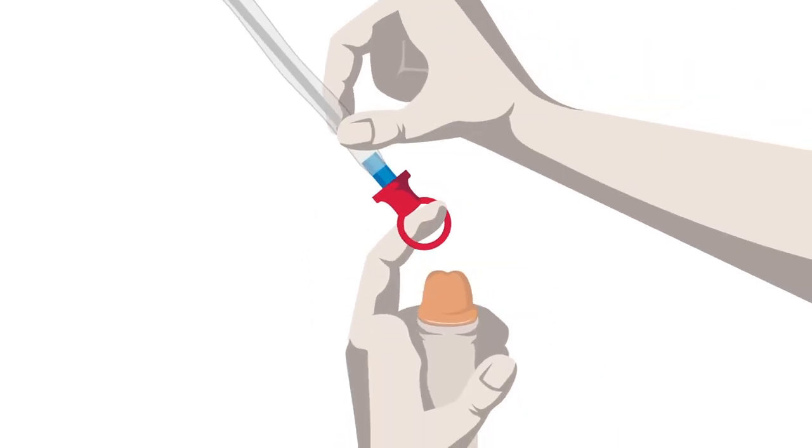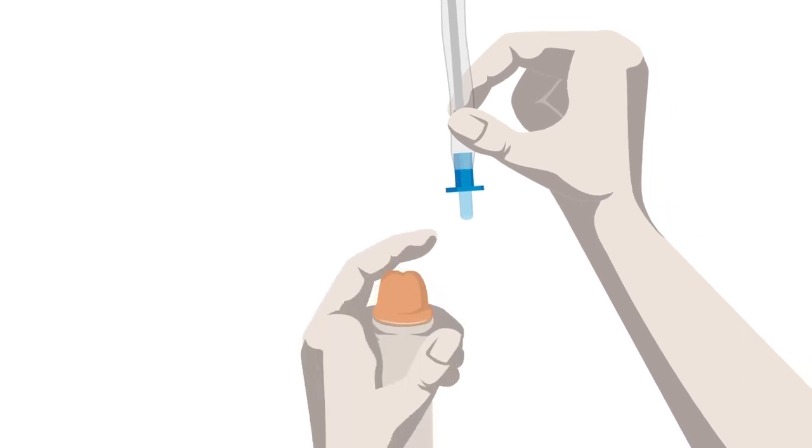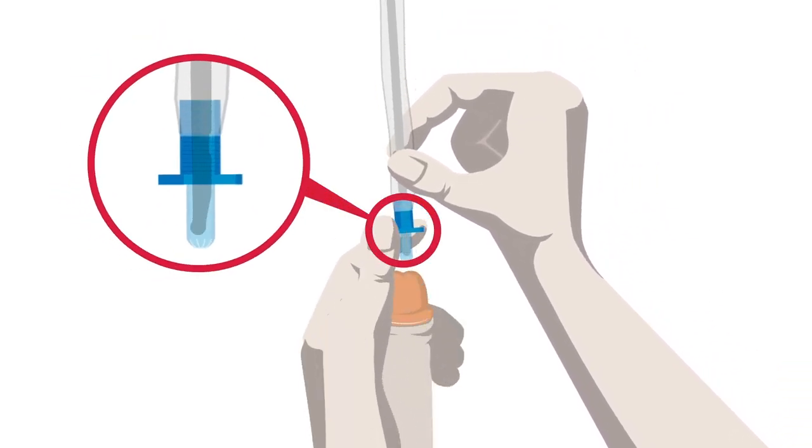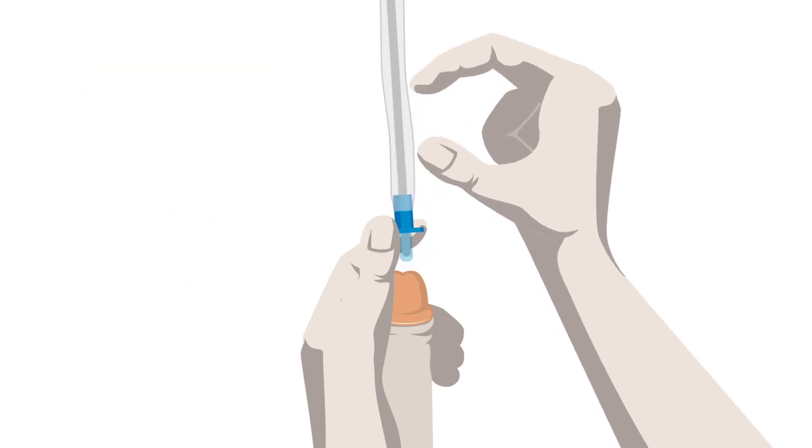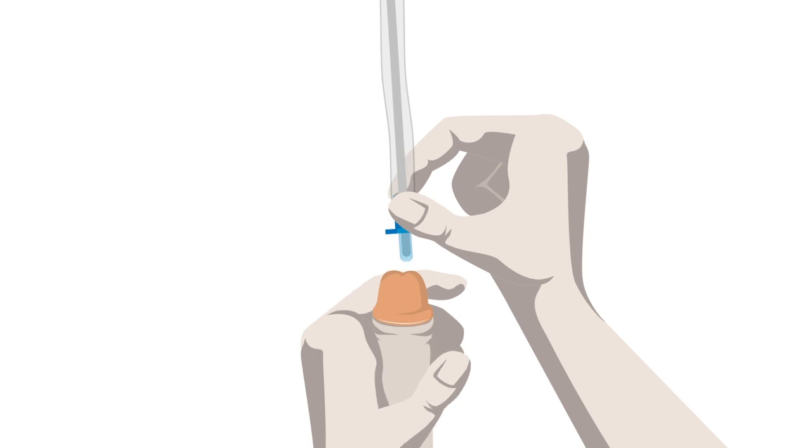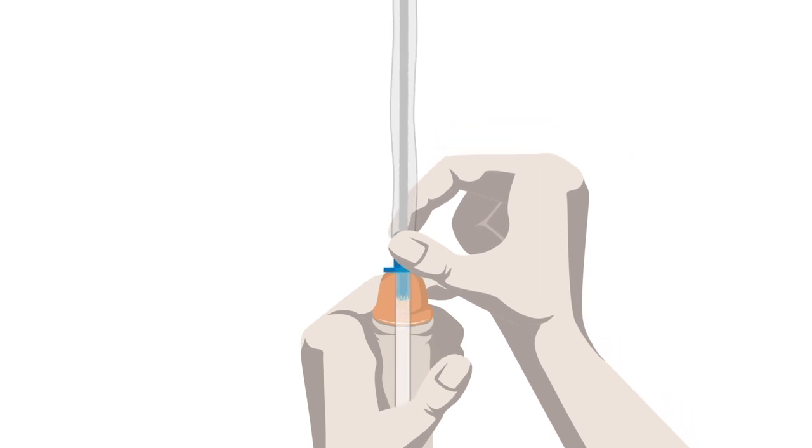Take the catheter. Remove the cap from the protective tip of the catheter. Then advance the catheter into the protective tip, ensuring it does not protrude. Grasp the catheter with your dominant hand below the protective tip plate and insert the protective tip until the base comes in contact with the urethral opening, as advised by your healthcare professional.